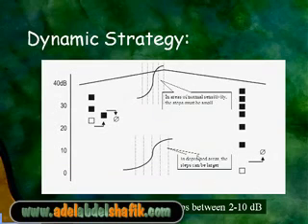On the other hand, if the program finds that the sensitivity is low, then on testing nearby points, it will assume that the sensitivity of these points is also low, and the difference in the intensity of the stimulus between one and the next will be in large steps. So this is a dynamic reaction between the program used and the response of the patient, and this will shorten the time of the procedure.